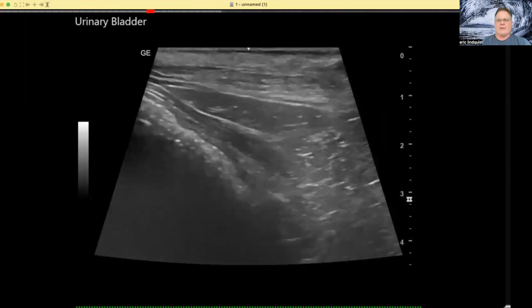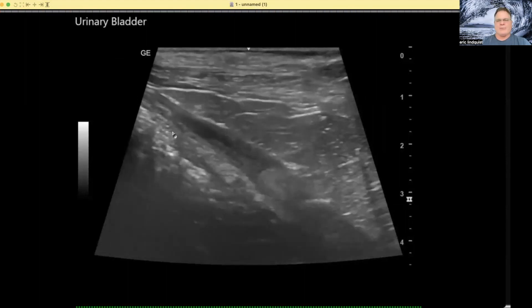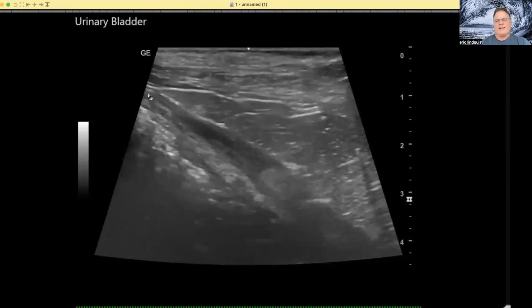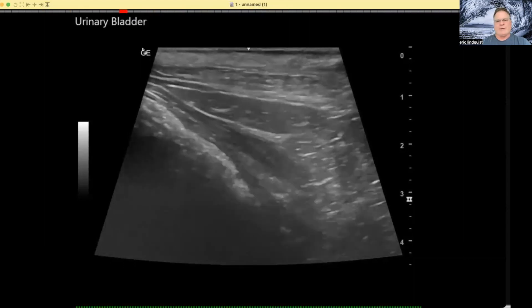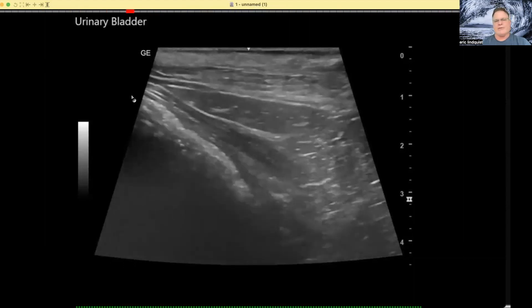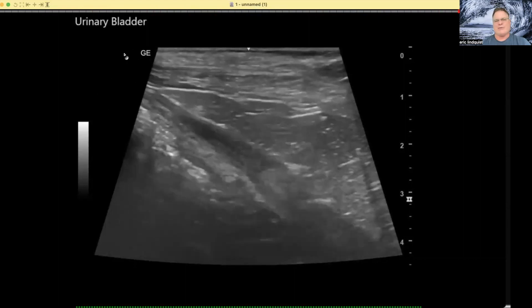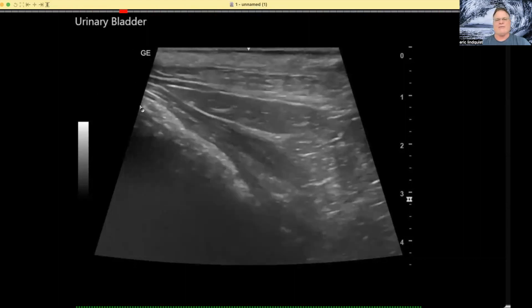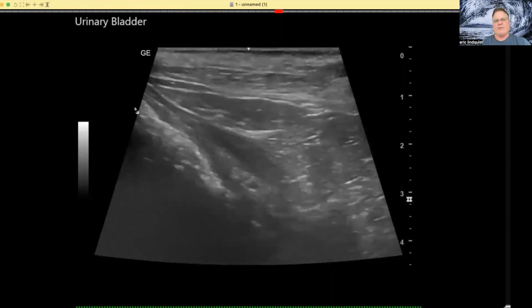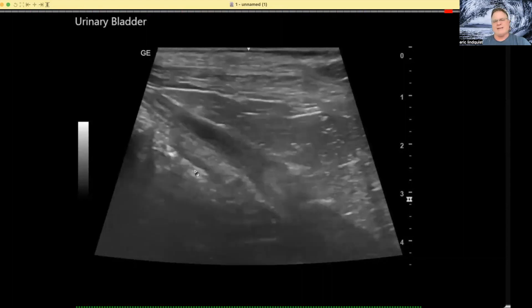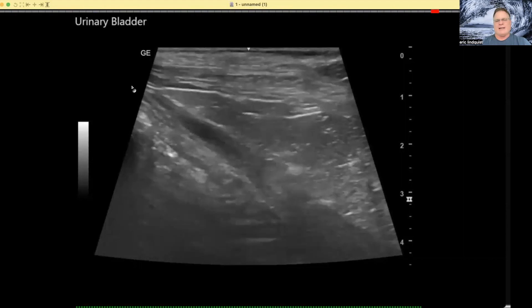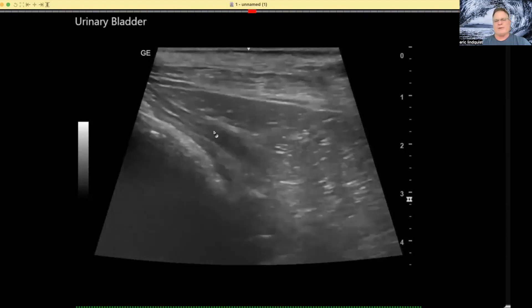As you can see, we go from S-DEP 1 to 2 to 3, and we're down in this pelvic urethra. The bladder is way over here, the cystourethral junction is over here. You turn that C of the cystourethral junction into a V. And as you turn that C into a V, the pelvic urethra comes in along with the descending colon. So you have dyschezia covered and you have pollakiuria and dysuria covered.